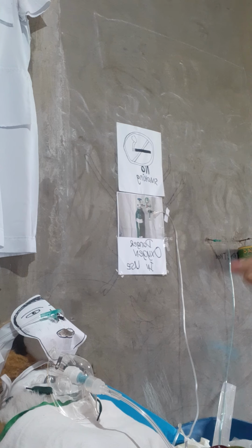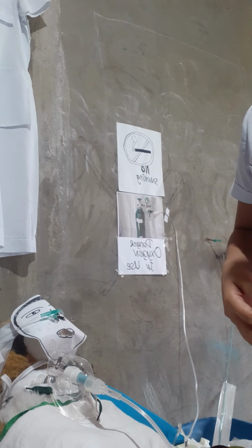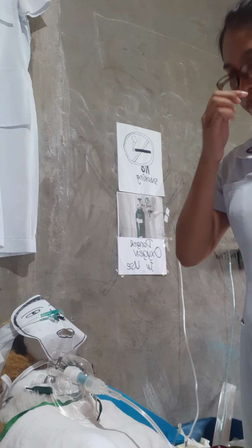After performing hand hygiene, we need to reassess the patient's respiratory status, including the respiratory rate, effort, oxygen saturation, and lung sounds. Then, for documentation, we need to record the respiratory assessment before and after the tracheostomy care.